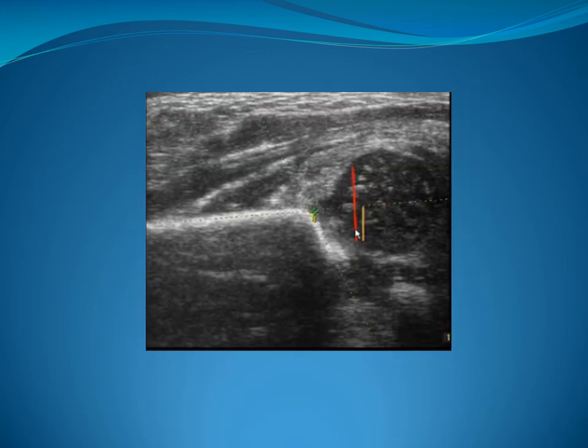Another subjective way of assessing the femoral head position is that we take the normal baseline, then at the end of the acetabular roof, at this point, we take a vertical line to measure the whole head of the femur. Usually about half of the head is seen inside or below the baseline, as shown in this image.